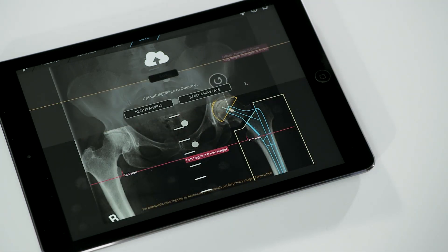TromaCAD Mobile allows for fast and simple orthopedic planning on a variety of mobile devices. Take planning one step further and download TromaCAD Mobile from the App Store.